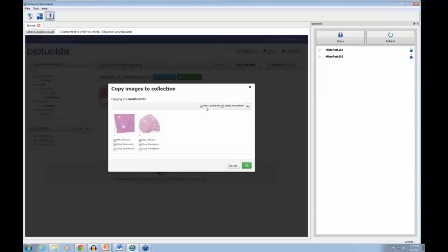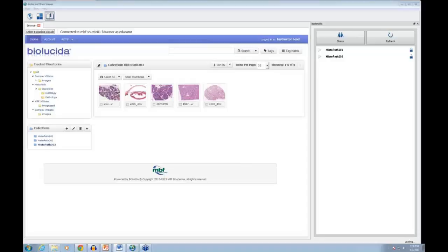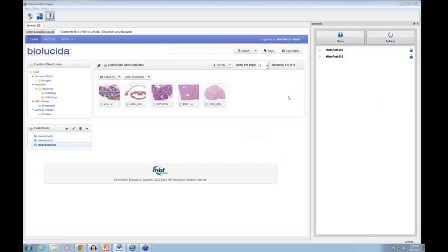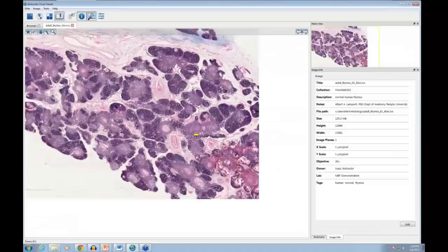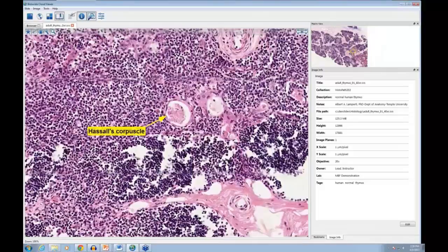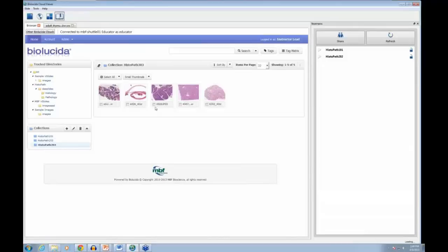Now I have a few images copied into this study guide collection. Annotations are a way to convey information directly on the virtual slides themselves — they're a set of drawing tools for delineating areas and regions, and labeling cells and anatomic features. Here's an example where I've already done one — you can see a yellow dot marking Hassall's corpuscle even at low zoom.